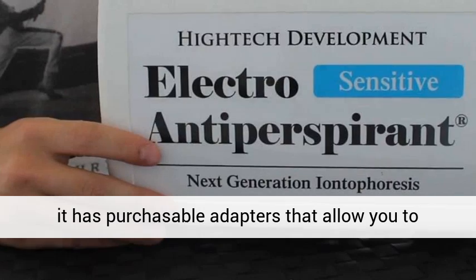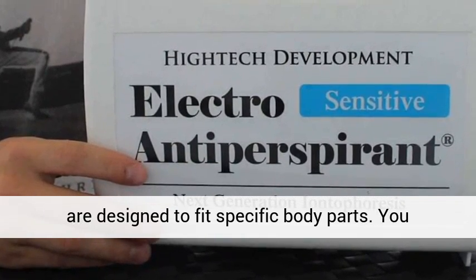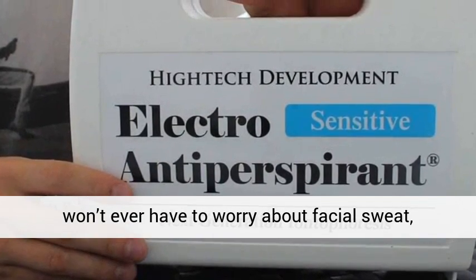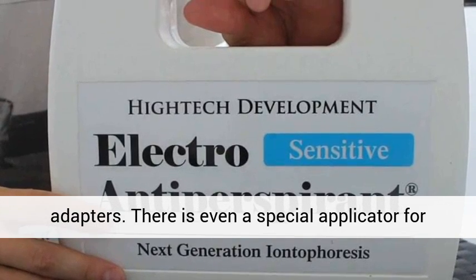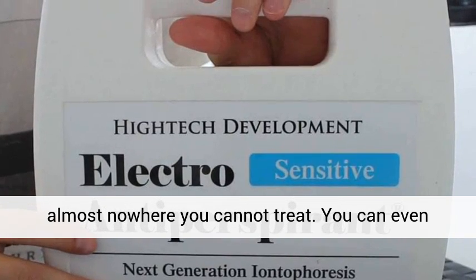These adapters are designed to fit specific body parts. You won't ever have to worry about facial sweat, scalp sweat, or forehead sweat with these adapters. There is even a special applicator for treating other places. With this unit there is almost nowhere you cannot treat.